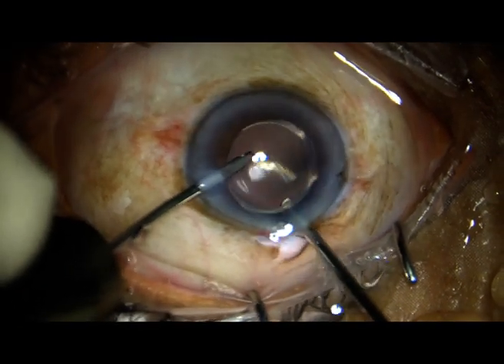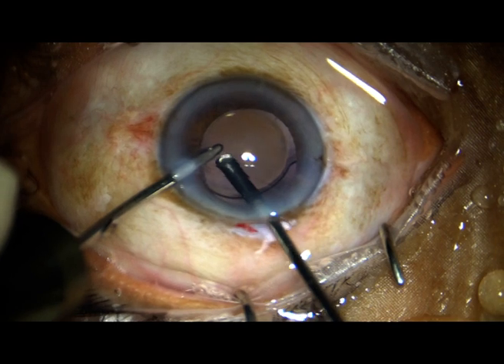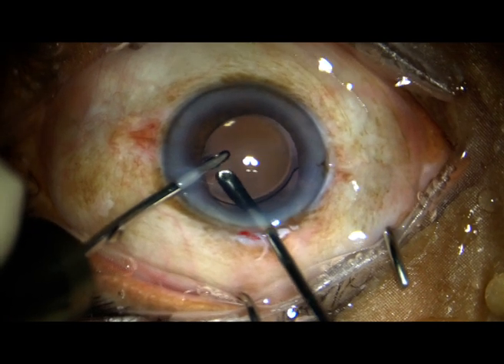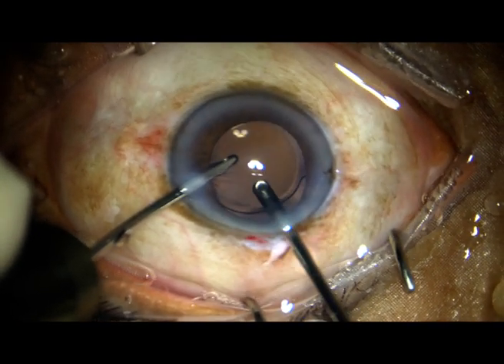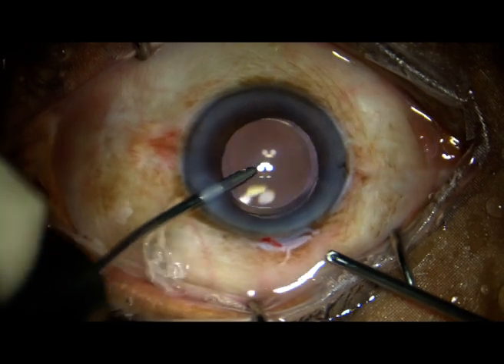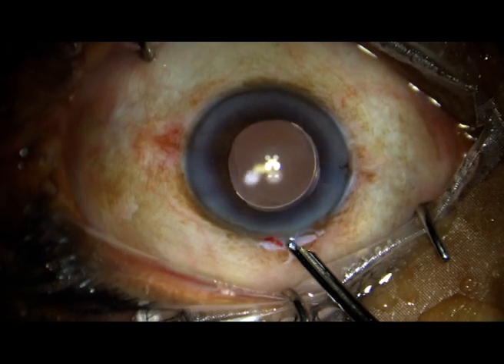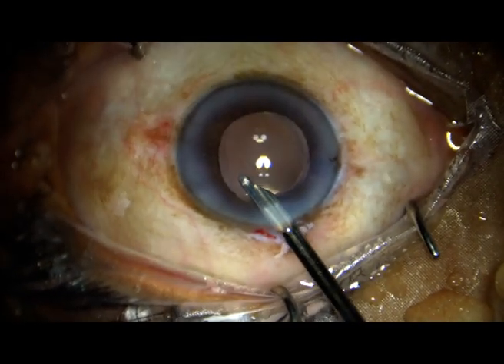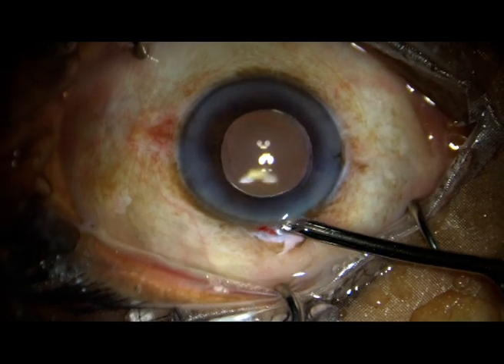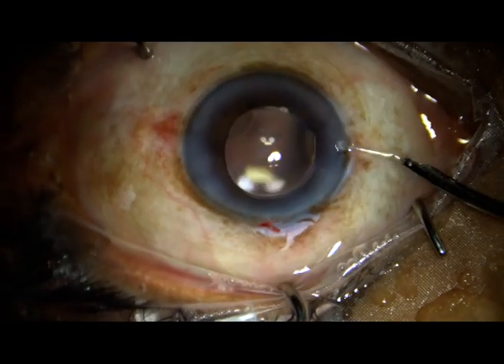This is the final cut because some amount of triamcinolone acetonide molecules go into the anterior vitreous. I usually remove as much triamcinolone acetonide as possible, because there are patients who can develop raised intraocular pressure because of triamcinolone acetonide. A final lavage of the anterior chamber is done, all the side ports are nicely closed by stromal hydration, the anterior chamber is nicely formed, and the case is concluded.